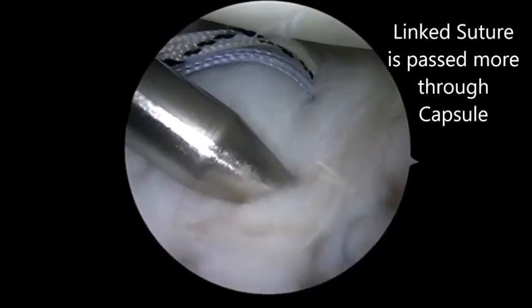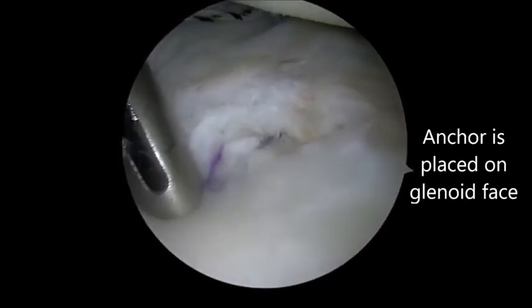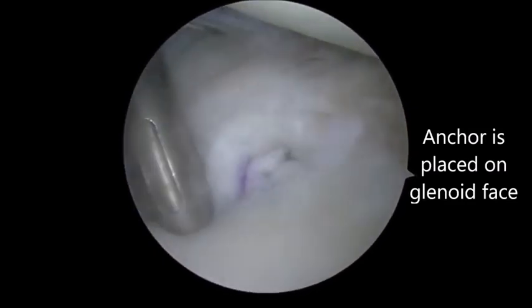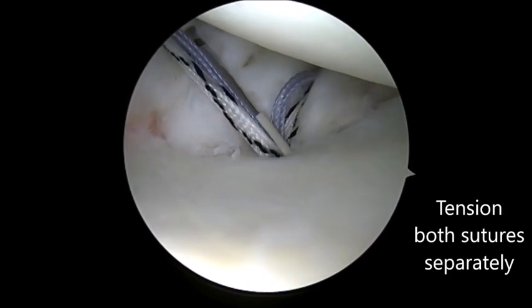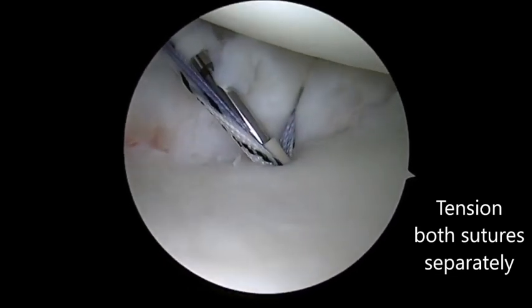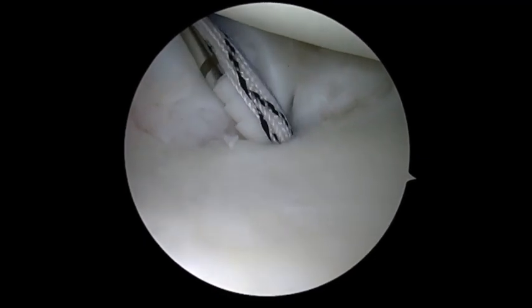The final product should have 2 passes, both the suture link as well as the repair stitch through the capsule. Both of these sutures are then brought with a drill over the top in order to fix the graft. Once the eyelet of the anchor is introduced, the sutures are tensioned differentially in order to tension not only the capsule but also the graft as well. Once appropriate tension is achieved, the graft is then placed.